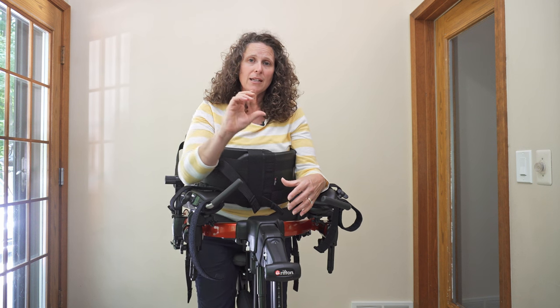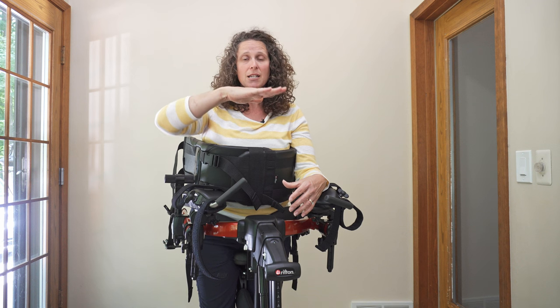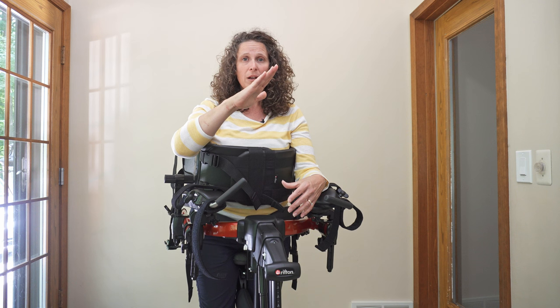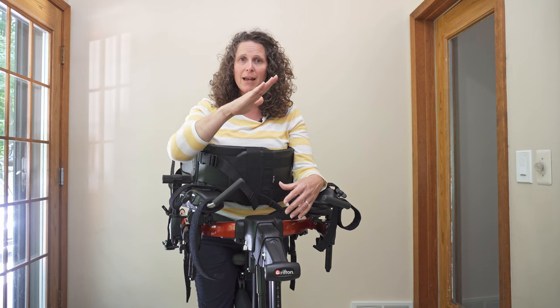If you have an MPS on your pacer, you can bring their pelvis forward. You could also change the tilt of it so that they have that posterior pelvic tilt, or to have them at neutral. Being at neutral might be too much for them.